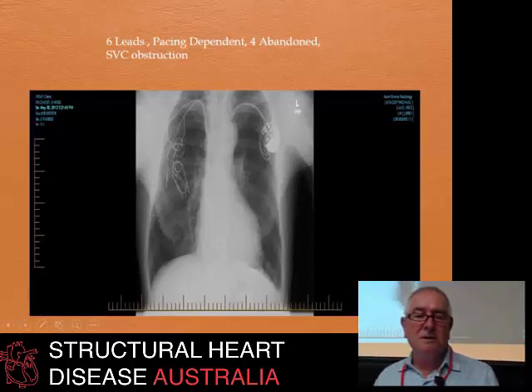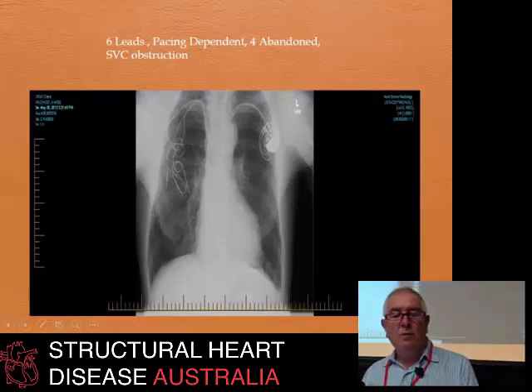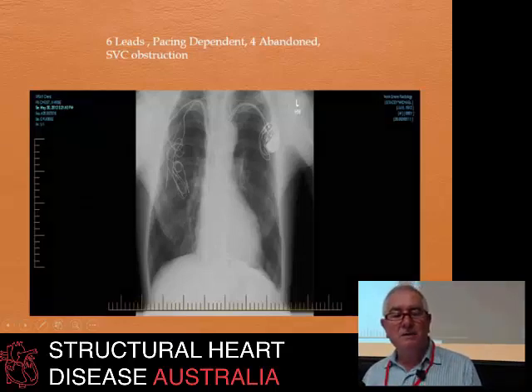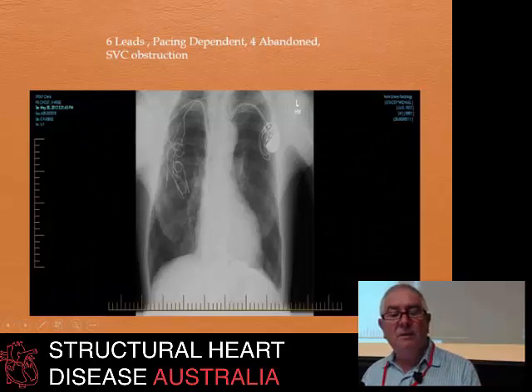This is one of the first patients I ever saw with an SVC obstruction: 4 abandoned leads there, 2 new ones put in over here, you know, someone else's problem. Pacing dependent, with severe symptoms of SVC obstruction. Every time he bent over he nearly passed out. Every morning he woke up, his head was swollen.